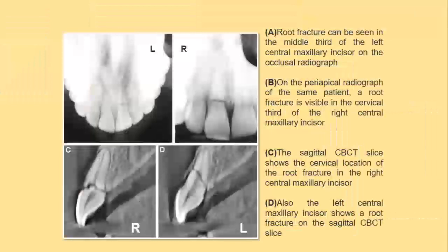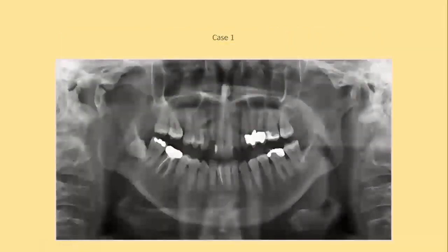So that's again an occlusal and IOPA showing you these, you see a fracture line there. But this tooth looks very typical on 2D imaging, which shows you nothing at all. But on a CBCT, you'll be surprised to see there's a fracture at the root surface. Yeah, this is all very obvious, right?